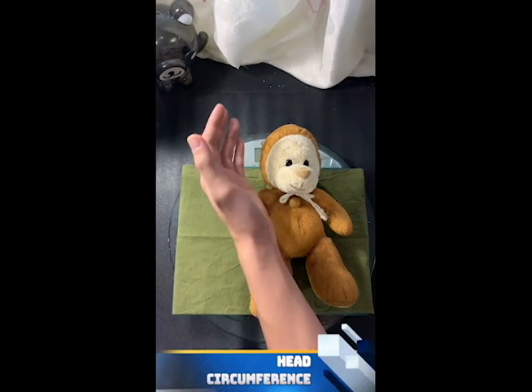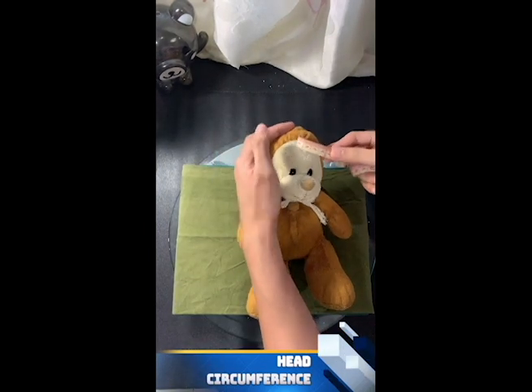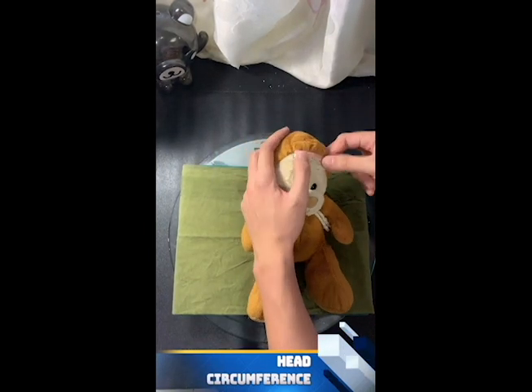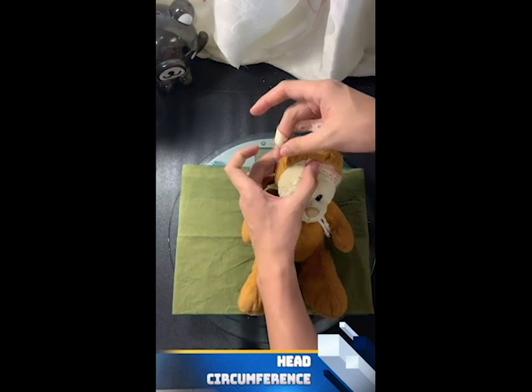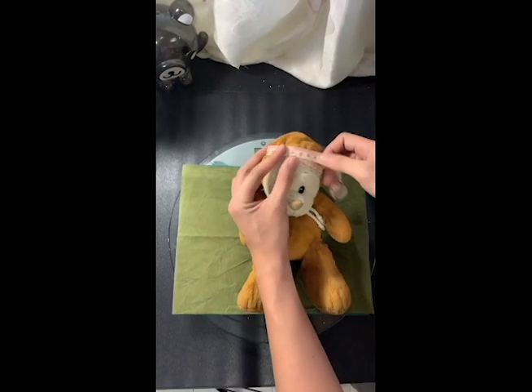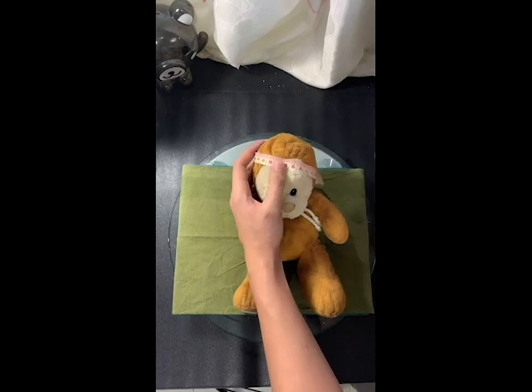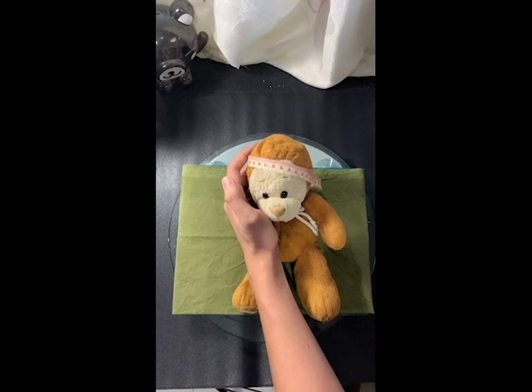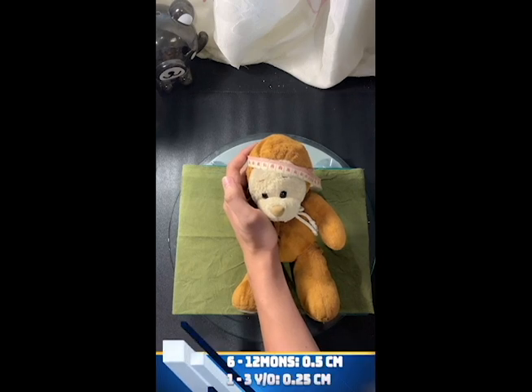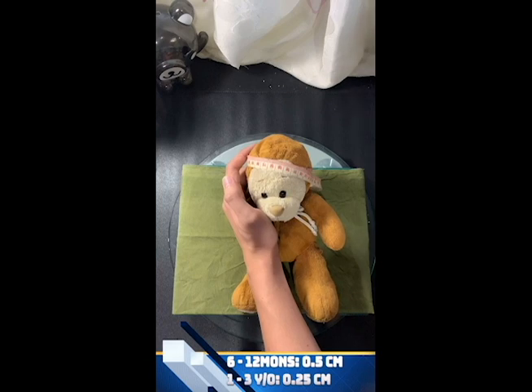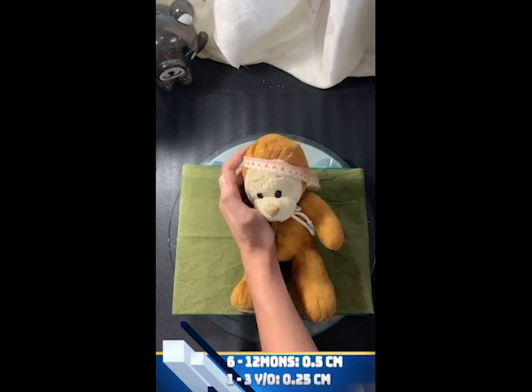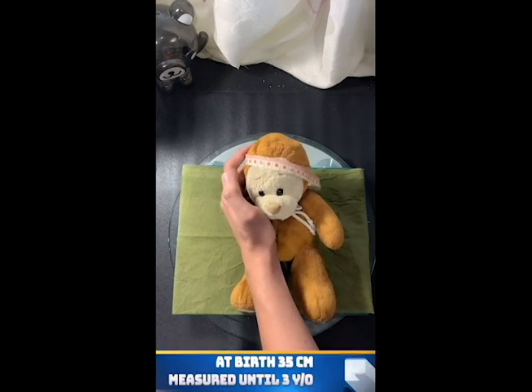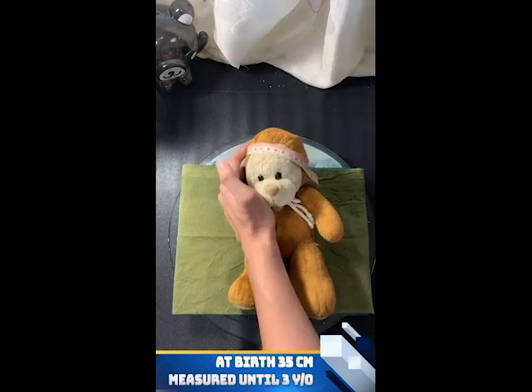For the head circumference, it is measured over the most prominent part of the occiput and just above the supra-orbital ridge. The average growth for head circumference from 6 to 12 months is 0.5 centimeters, and for 1 to 3-year-olds, 0.25 centimeters. At birth it should be 35 centimeters and should be routinely monitored during the first 3 years of life.